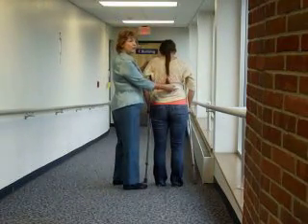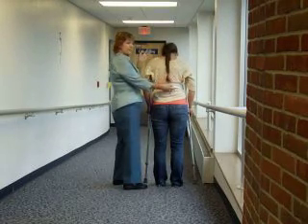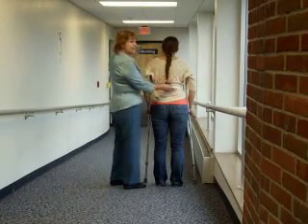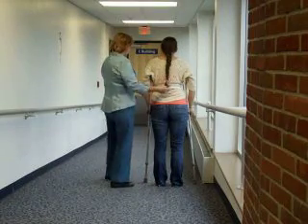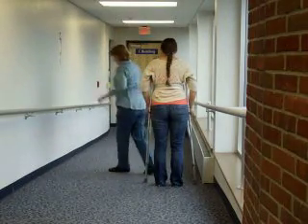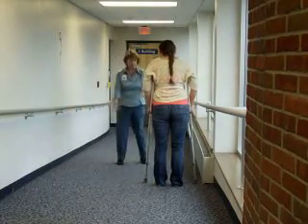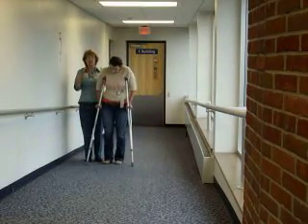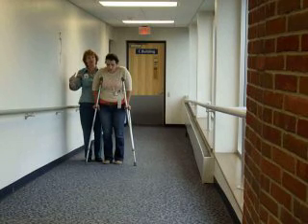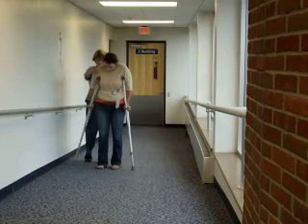This is one where you could regress by using the rail. You can't do too much else to regress except maybe shorter steps or slower. When she gets down to the bottom, she would do her normal turn. At the bottom, she would do crutch, opposite foot, crutch, opposite foot. And then when she gets back to the ramp again coming up, this time it's going to be foot, foot, crutch, crutch. It doesn't matter which foot goes first as long as both feet are ahead of the crutches.